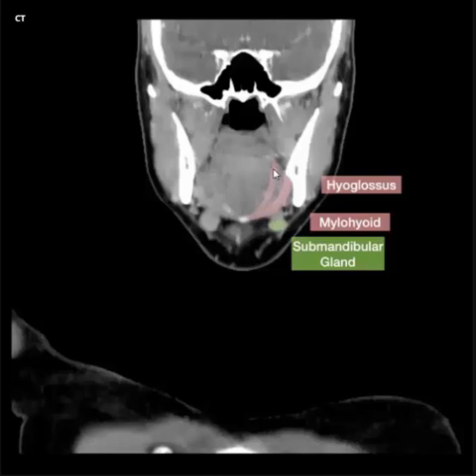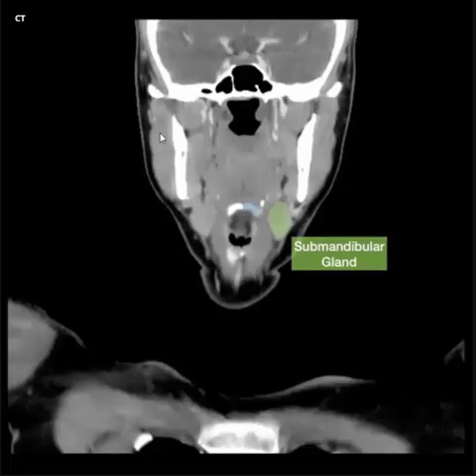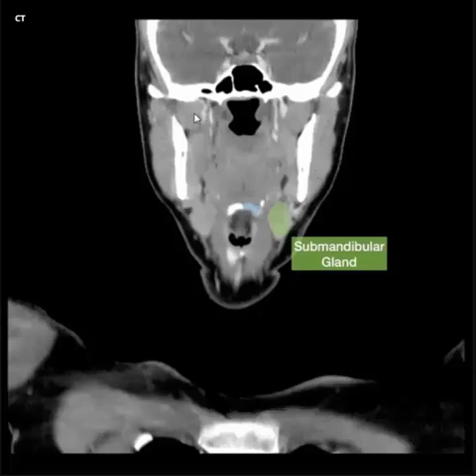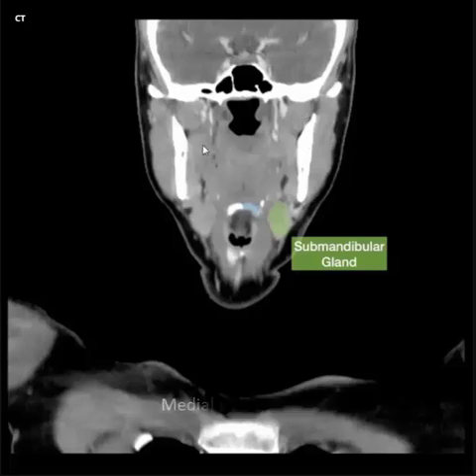Hyoglossus muscle. Mylohyoid muscle, right and left submandibular gland, right and left masseter muscle. Medial pterygoid muscle.